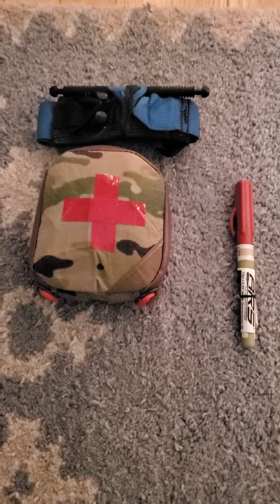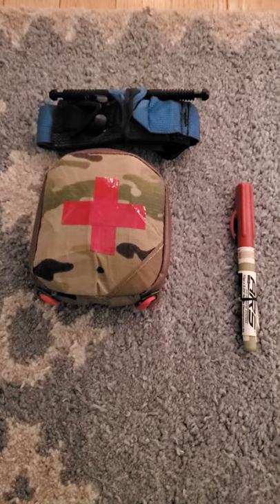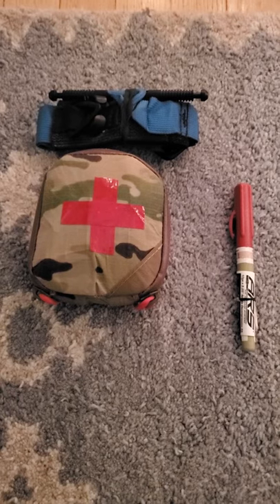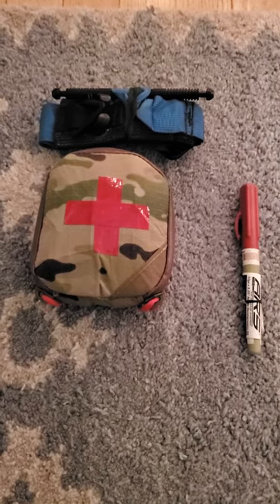This is the Crow Medical Slim Bleeder Kit, and it's the small size. I also carry an NCD next to it in the back pocket, sidecar style, and a full-size TQ usually in a front pocket.